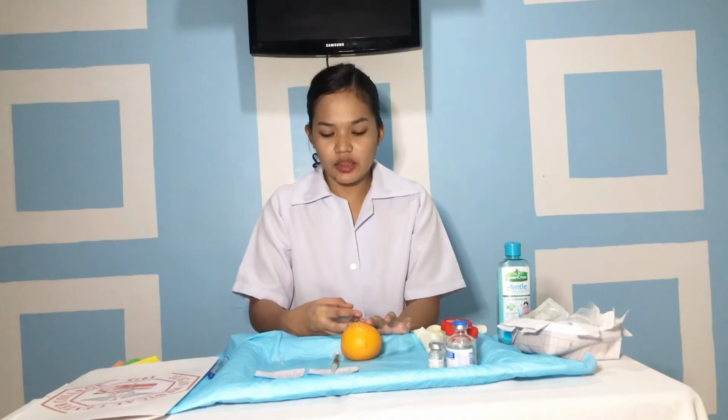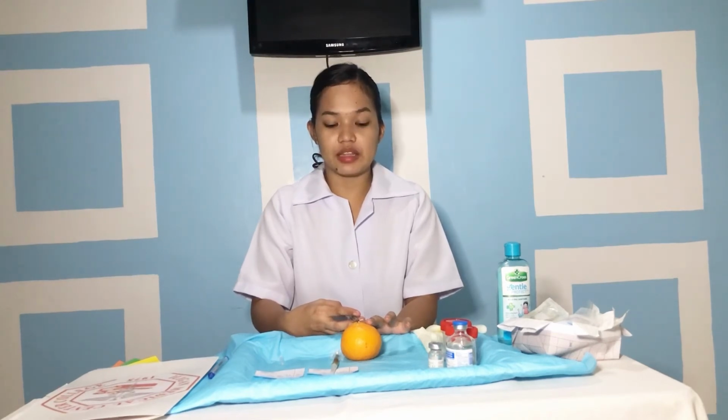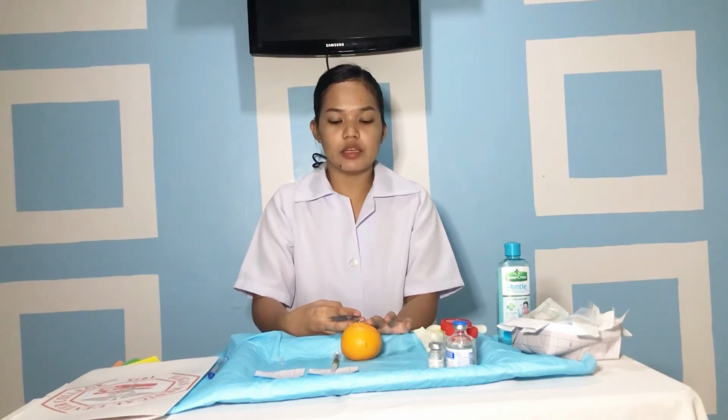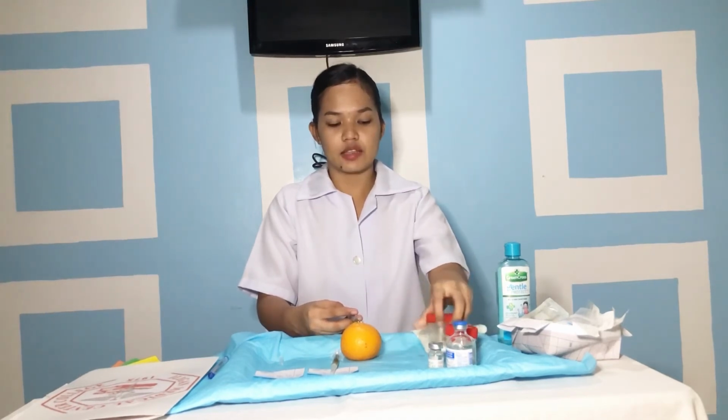So while injecting the medication, we notice that a small bleb, 1/4 inch in diameter, appears on the surface of the skin. So we should instruct the patient that this is normal. So the bleb indicates that the medication is deposited in the dermis. So now we withdraw the needle while applying an alcohol swab or gauze gently over the site.